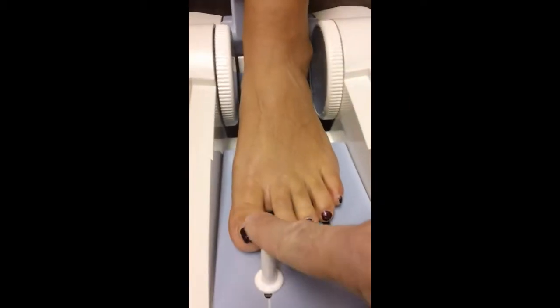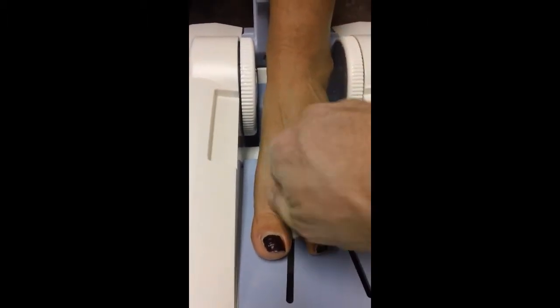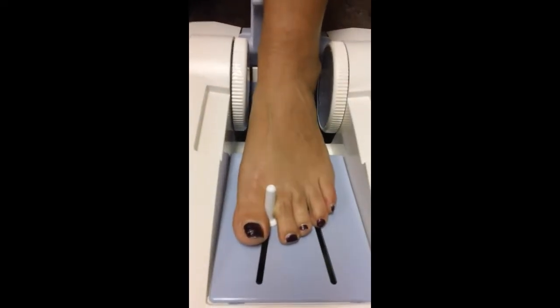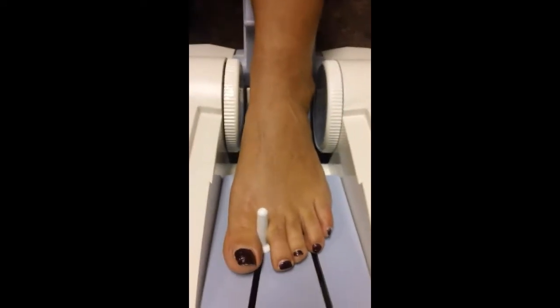There is a toe pin here that we can leave where it is, or if you want to be highly reproducible, you can slide that down. All the toe pin does is ensure that the foot is completely straight in the unit. A lot of people choose not to use it just for speed's sake, but to be completely correct, we'll use it today.